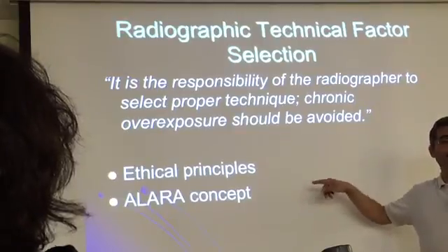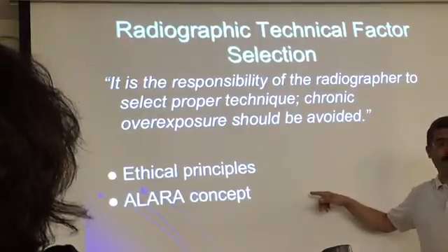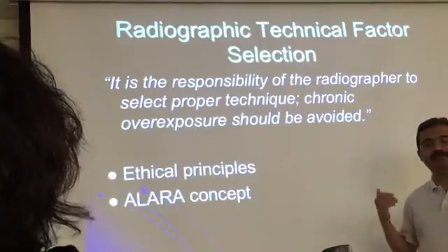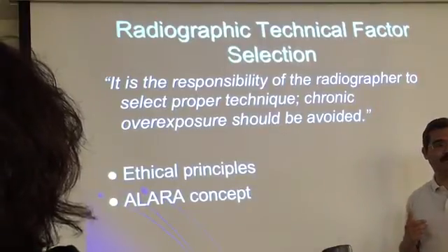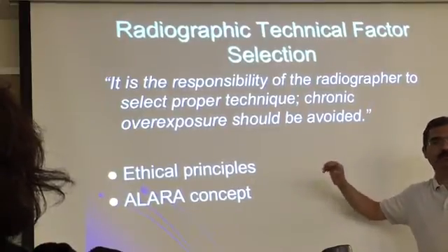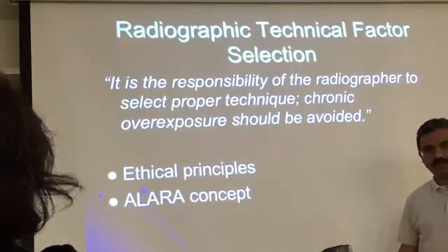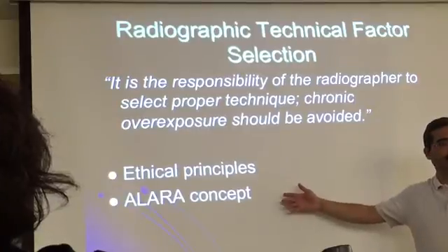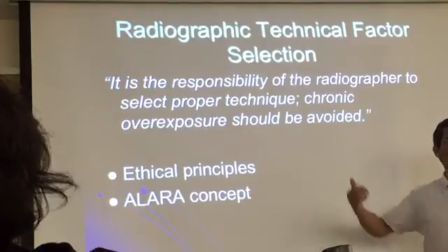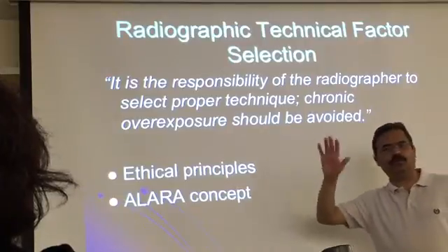You can overexpose a patient by 400%. I'm not talking 100%, 400%. A patient can be overexposed and the image still looks fine. If someone is really overexposing a patient by more than 200%, that person doesn't belong in this field. They don't understand any of the concepts of anything we're trying to do here. But it's possible. Can you underexpose patients? Yes, you can underexpose a patient by about 60%, and the image will still look somewhat okay.